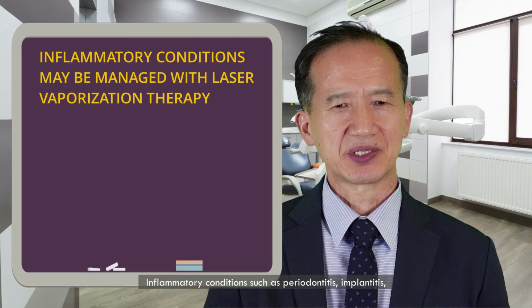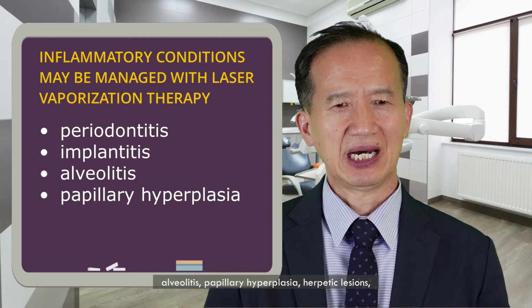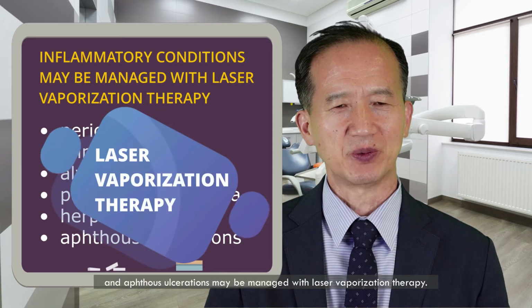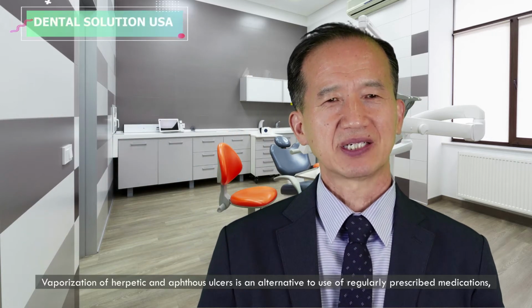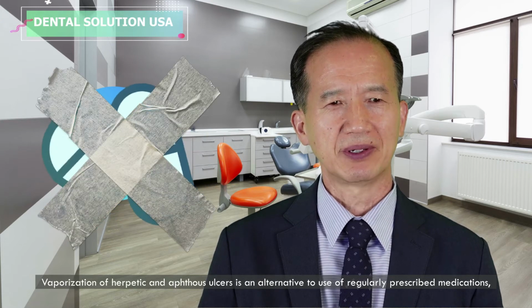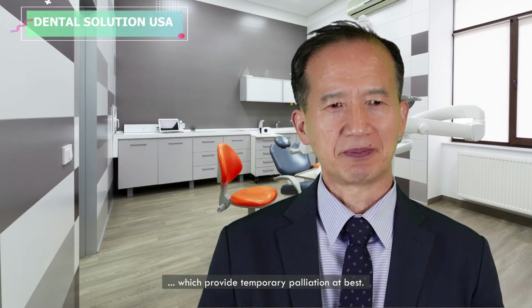Inflammatory conditions such as periodontitis, implantitis, alveolitis, papillary hyperplasia, herpetic lesions, and aphthous ulceration may be managed with the laser vaporization therapy. Vaporization of herpetic and aphthous ulcers is an alternative to use of regularly prescribed medications, which provide temporary palliation at best.